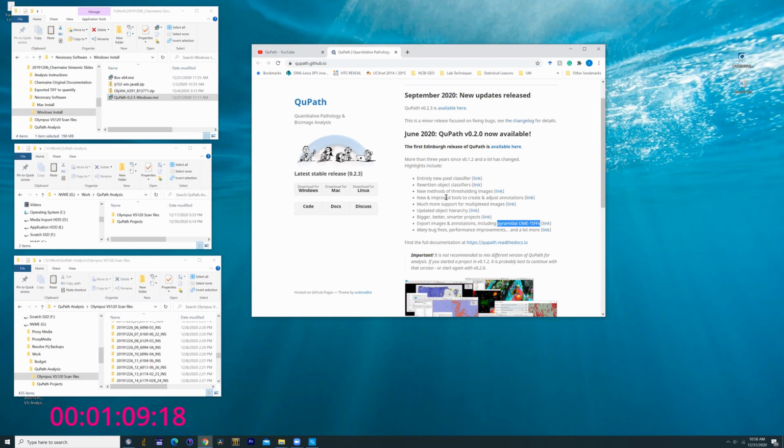Once you're in ImageJ, you can export it into any other format, and basically you can work with any image software out there, really. The issue is scaling these larger images down to a smaller usable format that's compatible with more common formats like TIFF and JPEG. The nice thing about the software, besides being free, of course, is that it also has its own YouTube page.